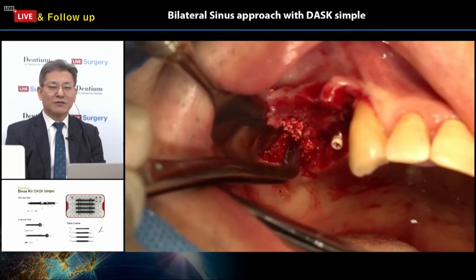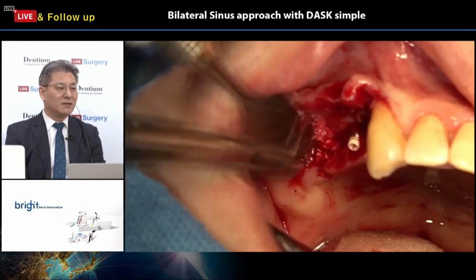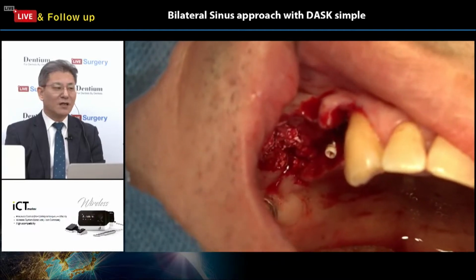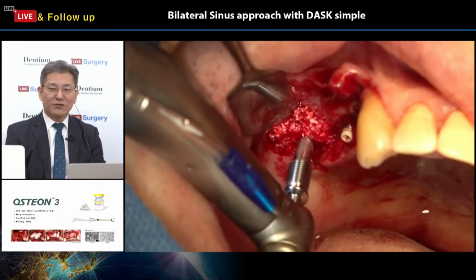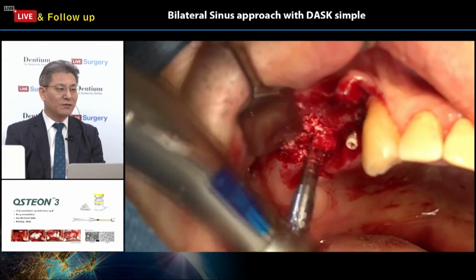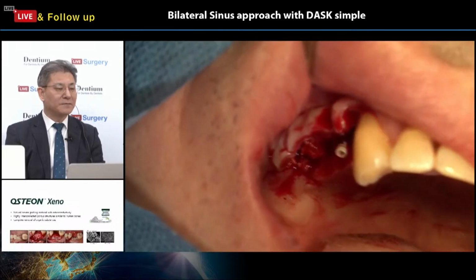Okay, they're pushing the graft materials into the sinus cavity, all the graft materials in there, with the crestal drill, and put the fixture, and that's it.